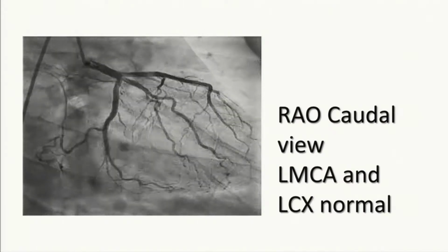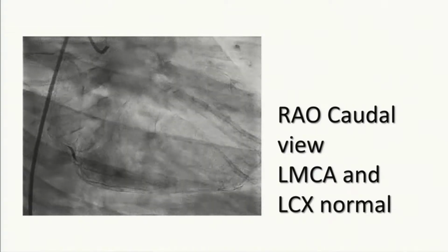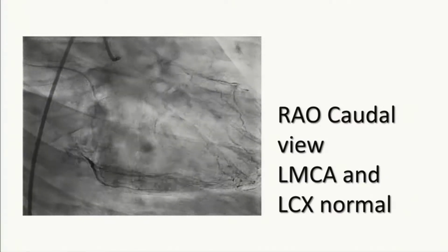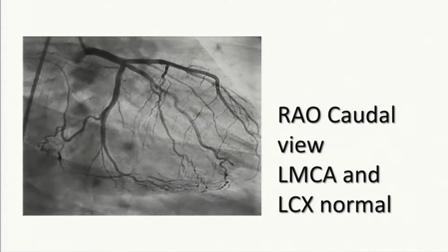Okay, this is a RAO caudal view. We find the LMCA is pristinely normal. The RCA shows a 100% occlusion of an ISR nature. So we have a CTO ISR with a long segment occlusion.